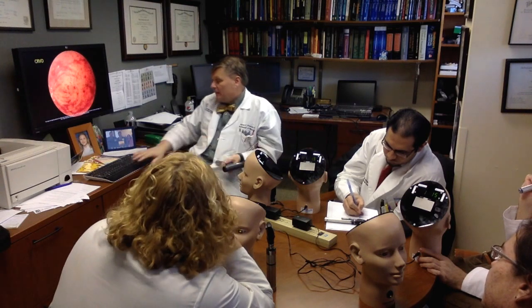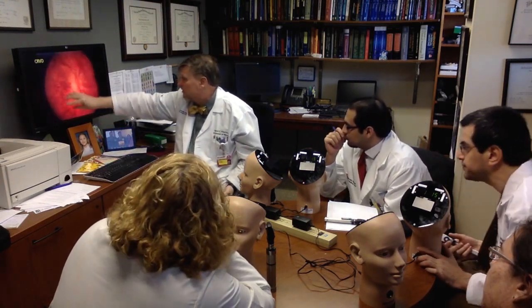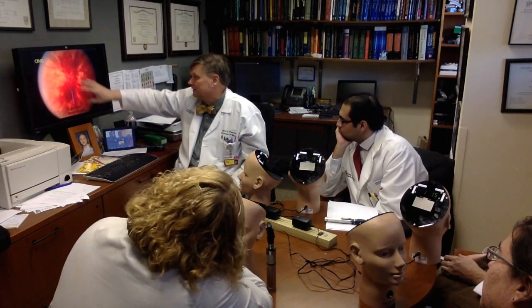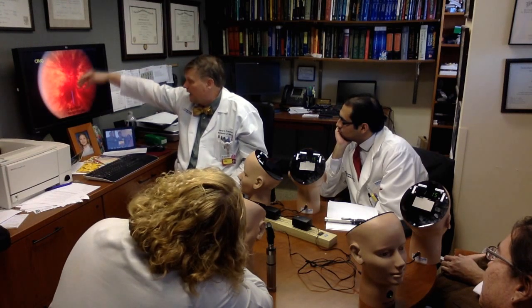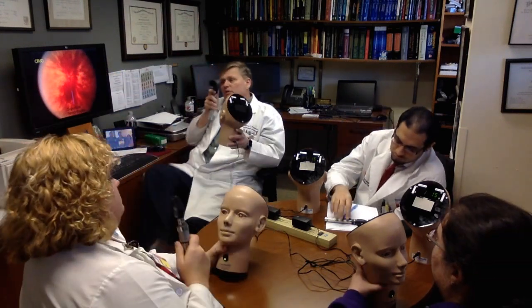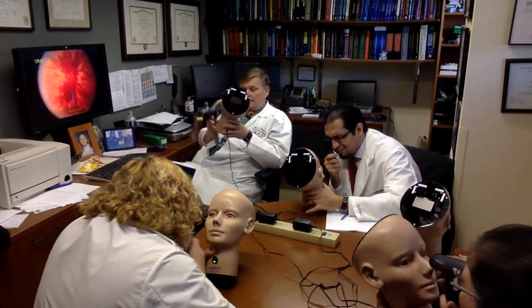That's what happens. So here's another one where, oh my God, all these hemorrhages throughout the retina. Here's another one, you say, oh my God, where is the disc? Well, we're going to guess it's someplace in here. Totally obliterated, no cup, and just hemorrhages galore. So let's look at this one again. 10 feet away. Focus, come in. Oh, my thing just went out again.